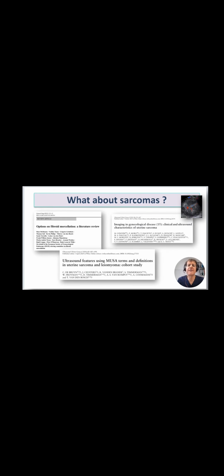The third question is, how many fibroids do you see? It's much easier to remove one fibroid than 10 or 12 fibroids at the same operation. So this is important information you have to put into your report, because these have clinical implications.